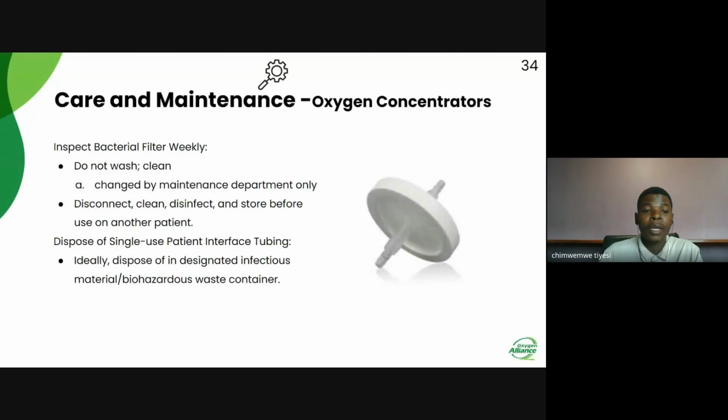Next, we are going to look at how you can inspect and do the maintenance of bacteria filters. You should not wash the bacteria filter, and the change should only be done by the maintenance department. If you want to use an oxygen concentrator on another patient, make sure you disconnect, clean and disinfect it before you move it on to another patient. Also dispose of any single-use patient interfaces if that's applicable in your setup. And ideally, you should dispose of them in designated infectious material or biohazard waste containers.